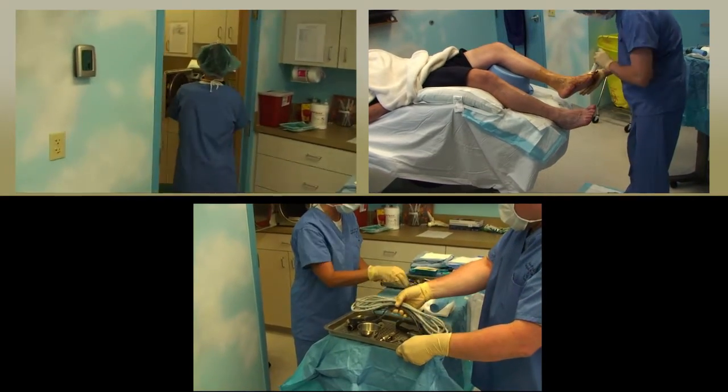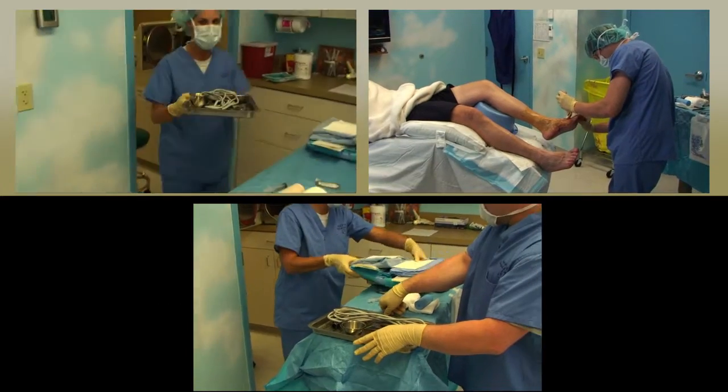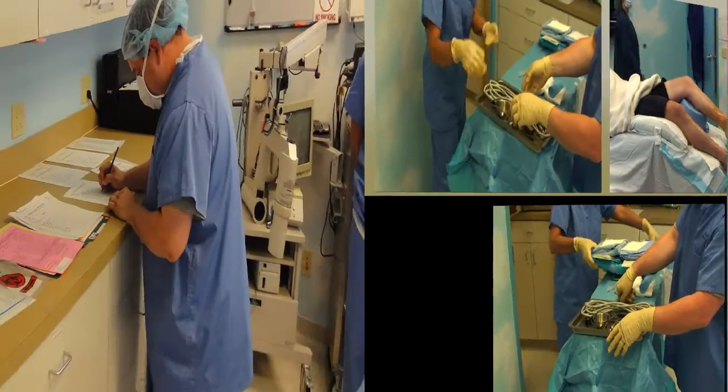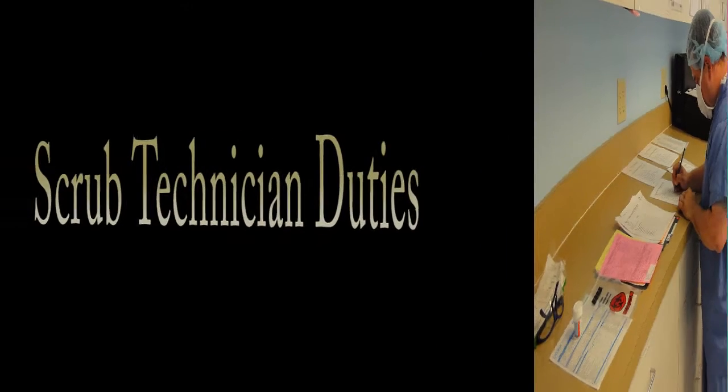At the end of your surgical day, you will need to ensure that each instrument set has been properly prepared, cleaned, scrubbed, and sterilized. You will also need to make sure that each case has had the proper paperwork filled out and signed by the physician. You will then turn your attention to helping the surgical scrub clean up and finish the operating room duties.